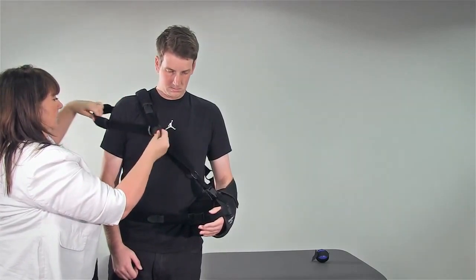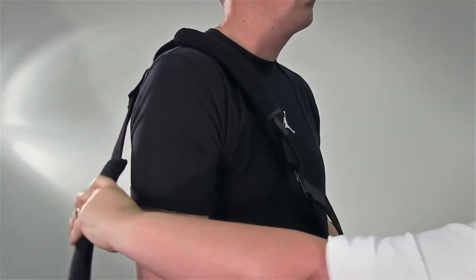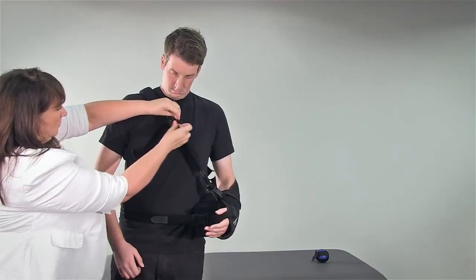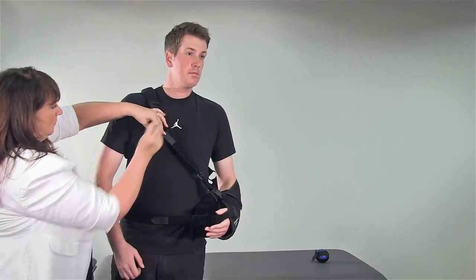Once the patient is awake or they are more mobile, undo the lower strap, put it under the patient's arm and then reattach through the O-ring and secure with the Velcro.